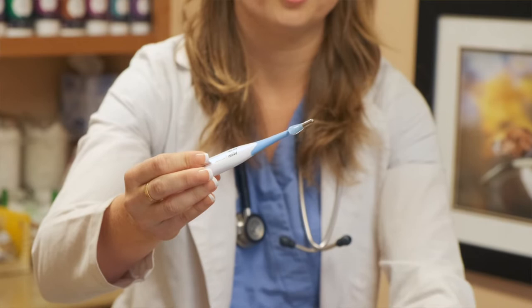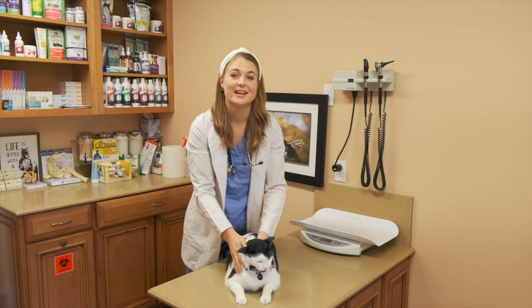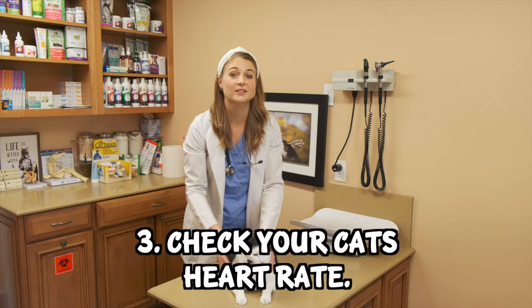A normal cat's temperature is between 100.5 and 102.5 degrees Fahrenheit.